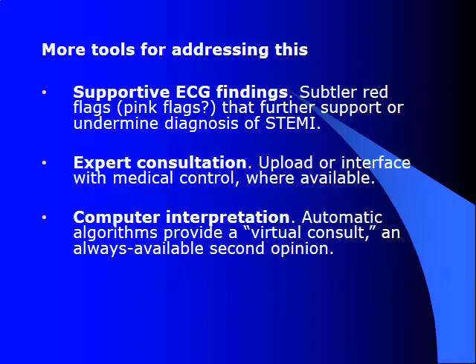Some more tools for addressing our inadequacies are going to be supportive ECG findings. These subtler red flags are going to support or undermine the diagnosis of a STEMI. Also, expert consultation, uploading our EKGs or sending them to our physicians at the ER, is a very valuable tool because we're able to put it off on the next guy. Which is a pretty good way of making sure that we're not going to get in trouble, at least. And obviously, it's going to be a good way to ensure patient advocacy as well.